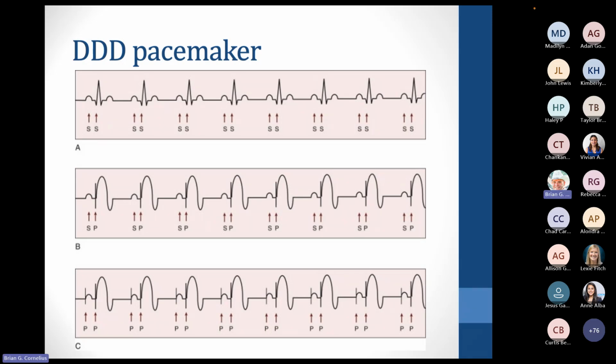This is just an example of some of the different pacemaker waveforms. Up top, you have a traditional QRS complex where you have the atria working and then the ventricles working. Down below, you have an atrial impulse. So the atria is still working normally on its own, but the ventricles aren't working. So you see that pacer spike and then the big QRS complex that follows it. The atria is following its traditional pathway. The ventricles are responding to the electrical stimuli.